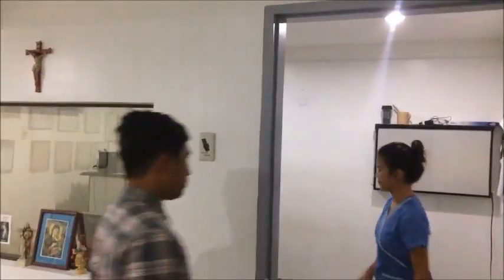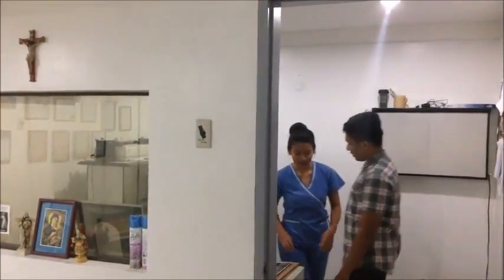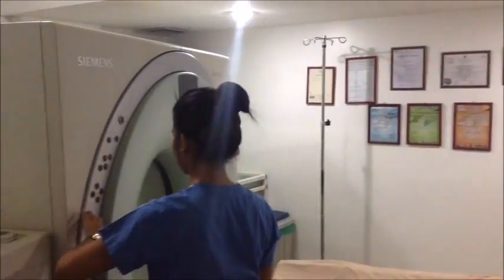Prior to the start of the CT exam, the technologist will explain the procedure to you and address any concerns you may have. Let your CT tech know if you are pregnant or think you may be pregnant. All metallic materials and certain clothing around the body are removed because they can interfere with the clarity of the image.